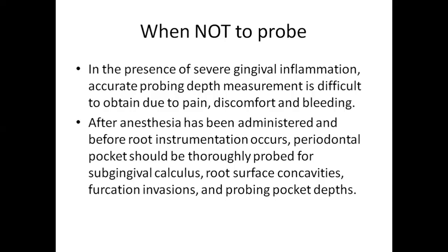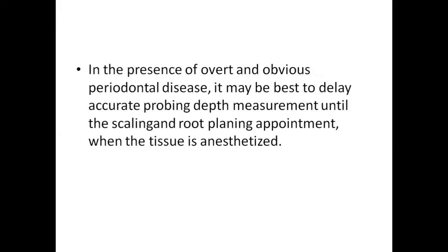Last but not the least, when not to probe. We have to take into care that in the presence of severe gingival inflammation, accurate probing depth measurement is difficult because of the pain, discomfort, and bleeding. So, when anesthesia has been administered before root instrumentation occurs, pockets should be thoroughly probed for subgingival calculus, any root surface concavities, any furcation involvements, and probing pocket depths. In the presence of overt and obvious periodontal disease, it may be best to delay accurate probing depth measurements until the scaling and root planing appointment when the tissue is anesthetized.